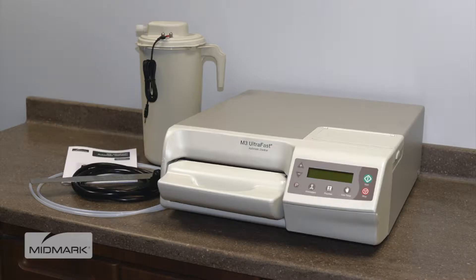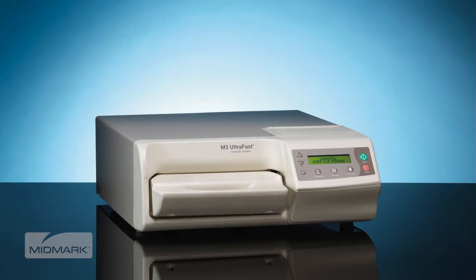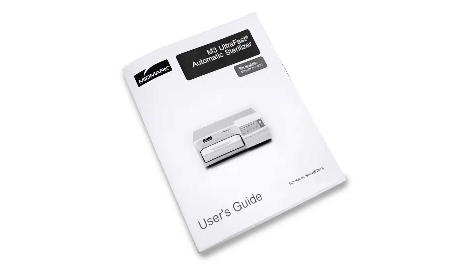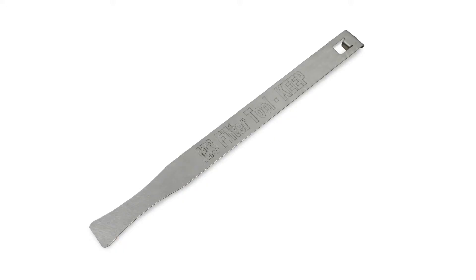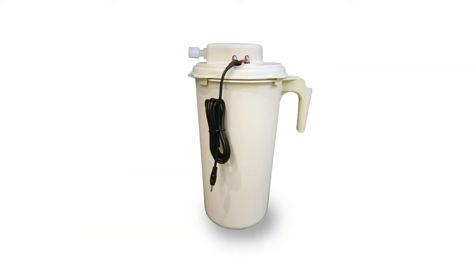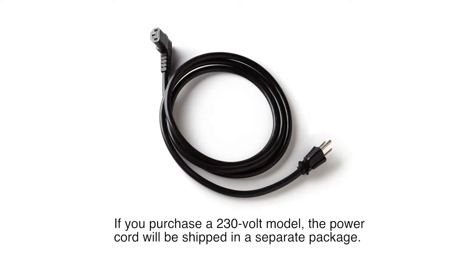Included with the M3 Ultrafast Automatic Sterilizer purchase, you will find the M3 Ultrafast Unit, M3 User's Guide, Quick Reference Guide, and User Training CD, Filter Change Tool, Drain Hose, External Condensing Tank and Tubing, and a Power Cord.